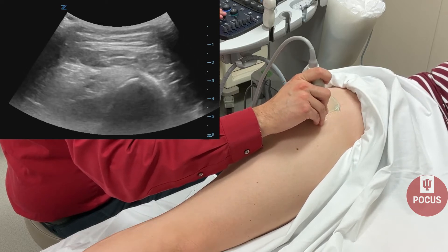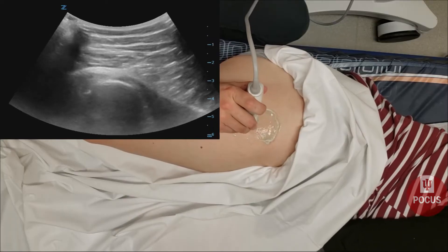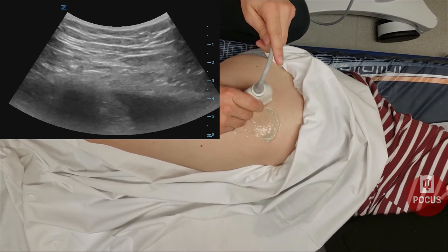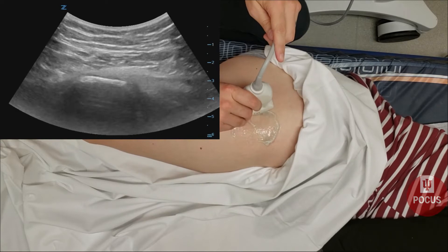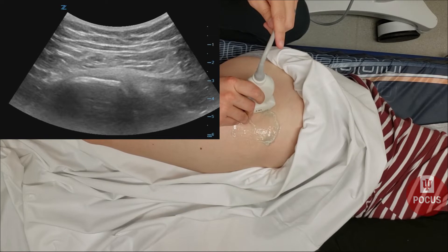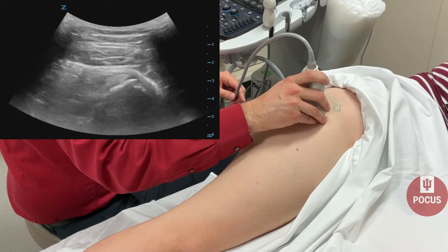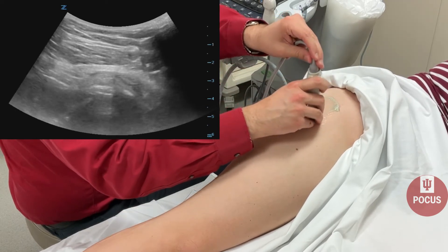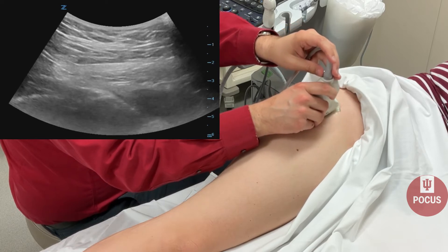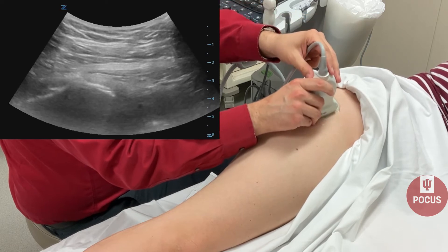We'll rotate to the posterior aspect of that greater trochanter, and this is going to be the gluteus medius tendon as it inserts on the greater trochanter. Then we'll go back to our home base of the rooftop and look at the anterior aspect, which is going to be the gluteus minimus muscle and tendon.